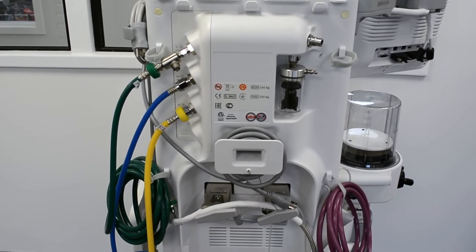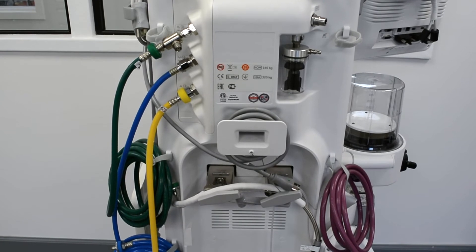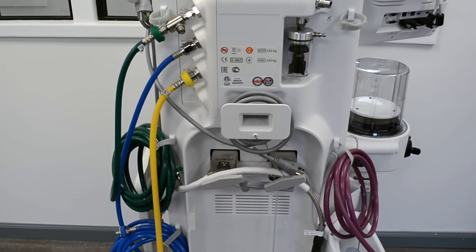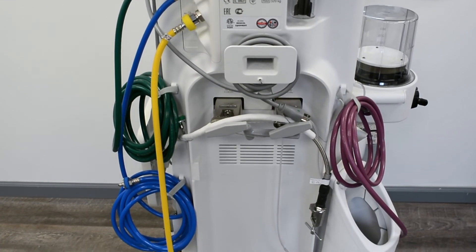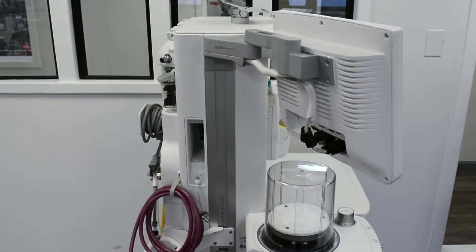Soma Tech International offers refurbished GE CareStation 620s up to 50% below the cost of new, with the same service and warranty contracts from the manufacturer.